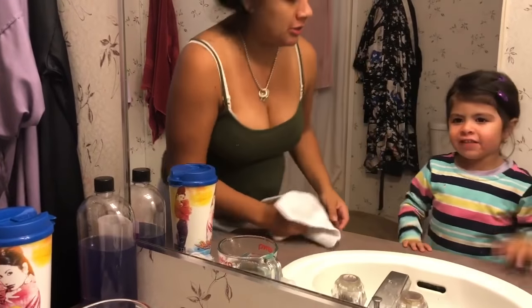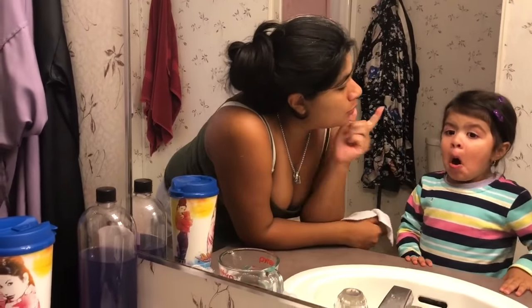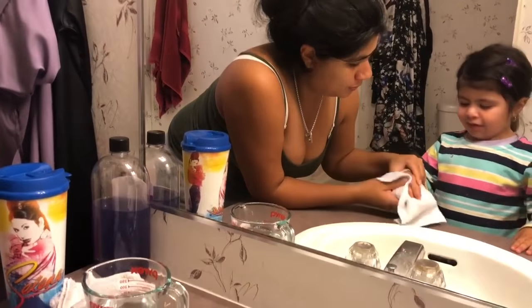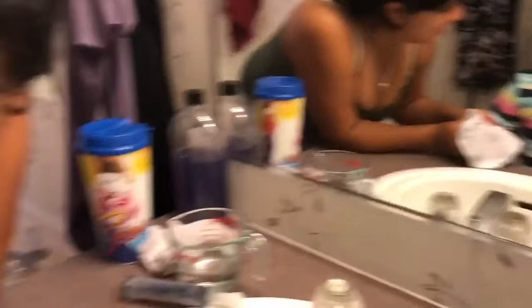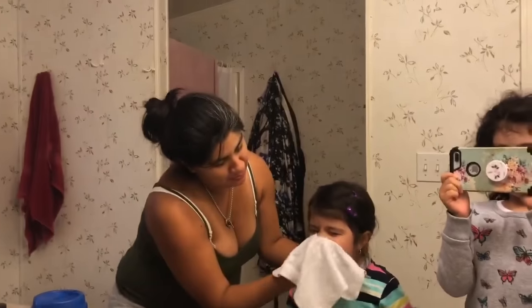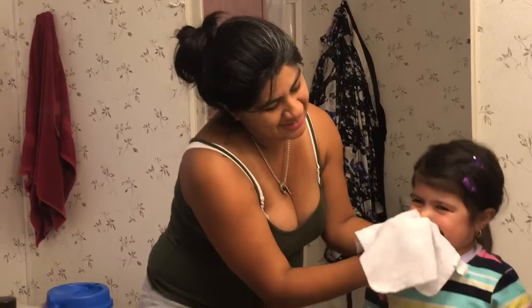There you go. Okay, breathe in. Am I supposed to do it like a dragon? Breathe with your nose. Again, breathe in. Breathe out.